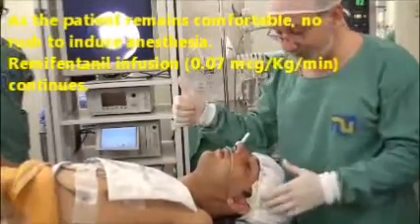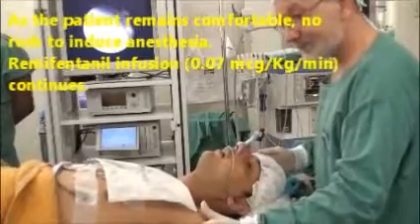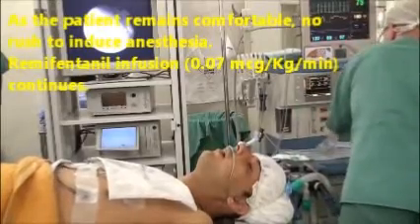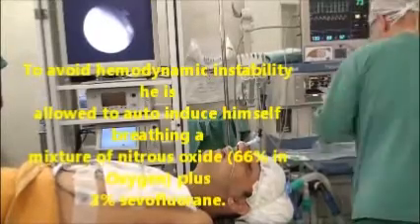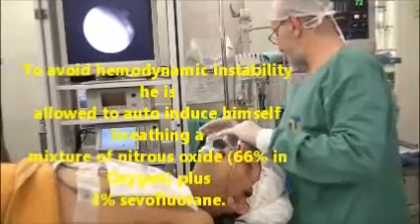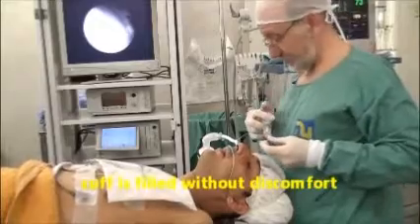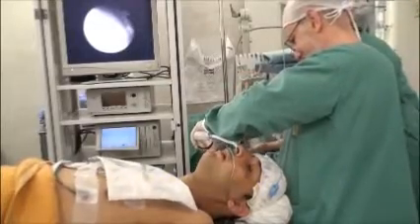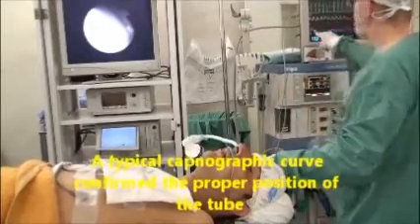Since the patient remained comfortable, conscious, and breathing by himself, we were not in a hurry to induce anesthesia. I'd like to point out the normal values that the monitors are showing at that time. Smooth induction of anesthesia is done by the breathing of a mix of nitrous oxide and sevoflurane by the spontaneously breathing patient. Typical capnographic wave confirms the proper position of the endotracheal tube.